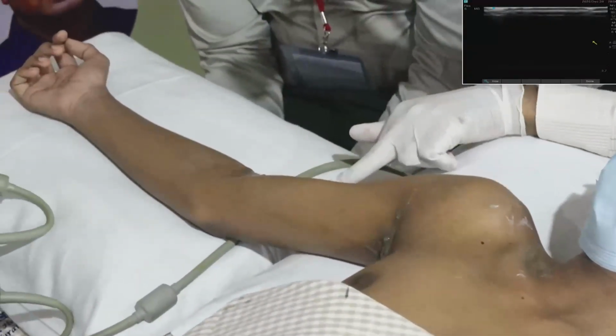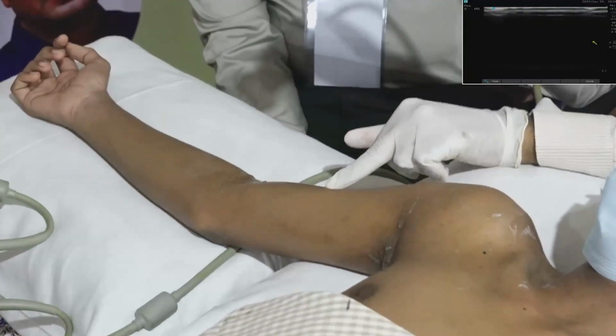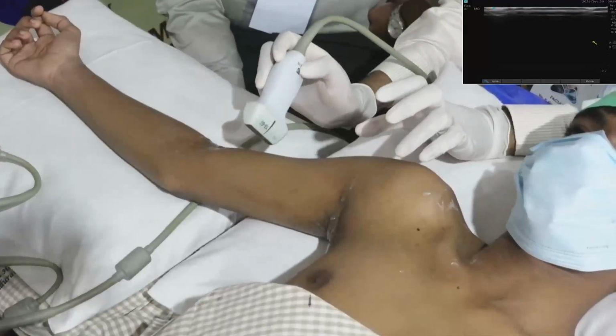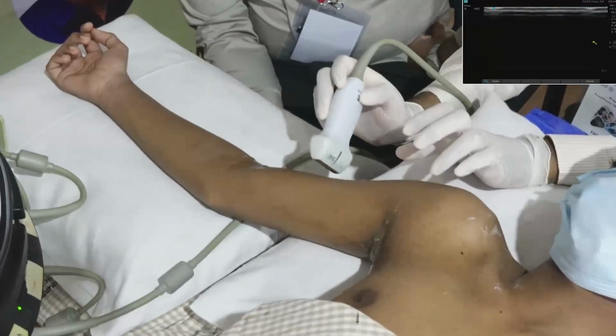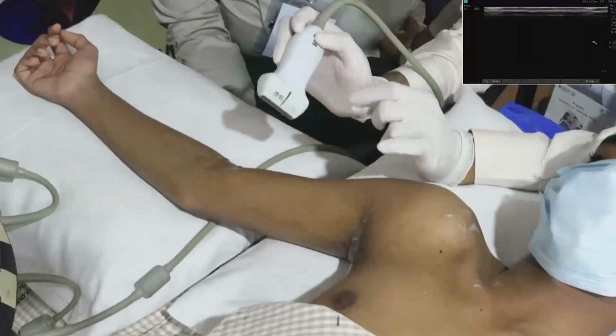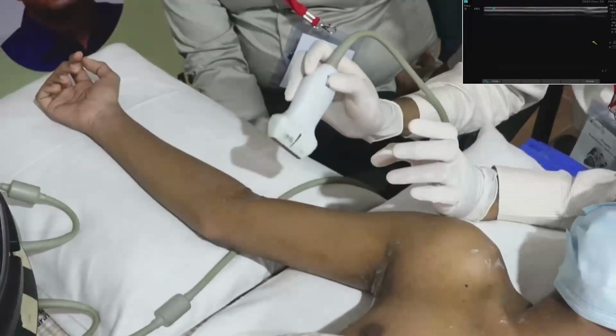Next preferred area is mid-humeral, because the radial nerve has not yet divided. Many times we think it is exactly mid-humeral. No, it is not exactly mid-humeral. Sometimes it is the upper one-third and lower two-thirds of the arm. Below the mid-humeral level, I think the radial nerve divides. That you have to keep in mind.